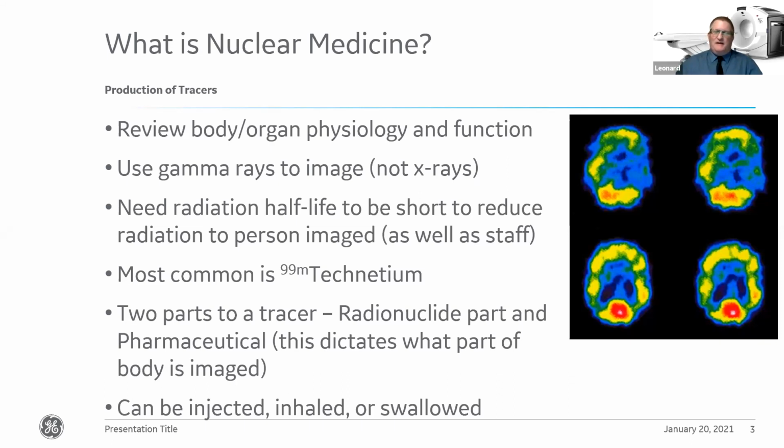And anybody who's been to a hospital environment to have a nuclear medicine scan might have seen the strange scenario where they put up the placard at the front and the sign detailing where the department is, and they changed the N and the U around to make it "unclear medicine", because that's some of the situation we are in. And that's purely because we look at functions.